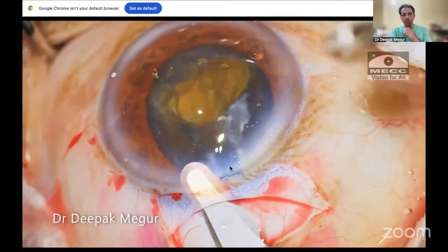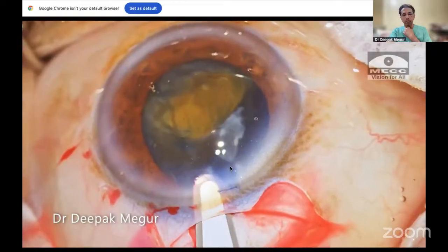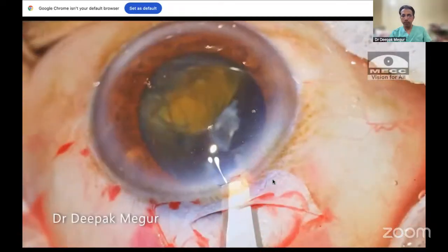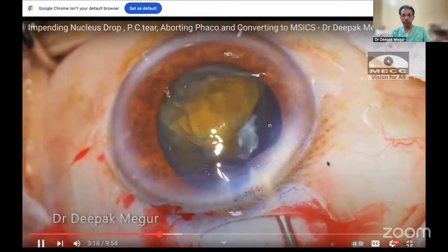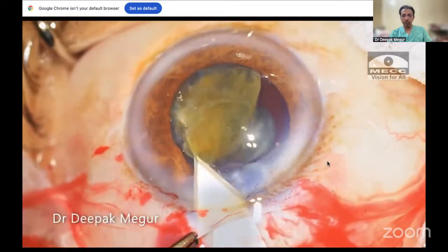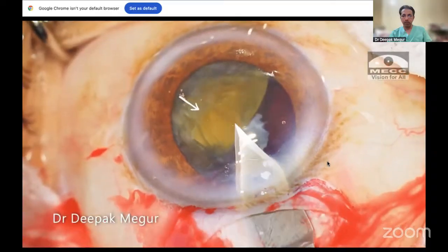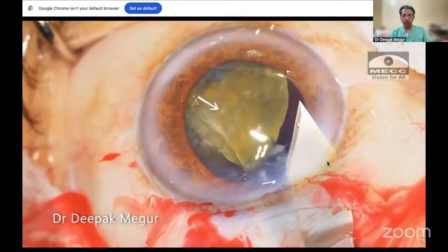A scleral groove is created, and using a crescent knife, a sclerocorneal tunnel is created. The tunnel is at a slightly deeper plane when compared to this side port incision, which was originally created for the phaco procedure. OVD inside the tunnel demonstrates the nice biconcave structure. The internal entry is done with a sharp keratome, and the sclerocorneal tunnel is extended on either side. As soon as the antechamber is entered, there is a momentary shallowing of the anterior chamber.